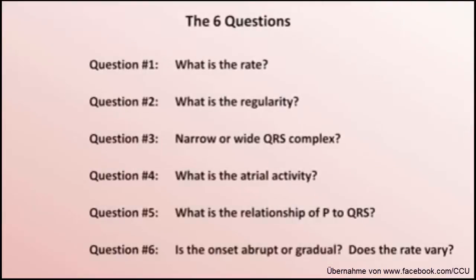So those are the 6 questions. These questions are individually very easy to answer, but when used collectively can give you the ability to diagnose complicated tachyarrhythmias that would otherwise be very difficult were you to use the more common pattern recognition strategy.